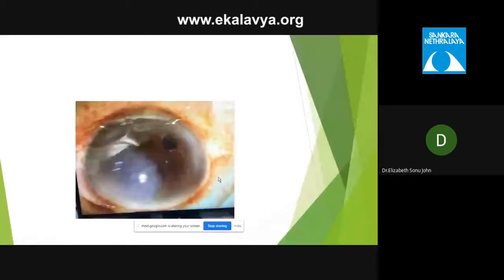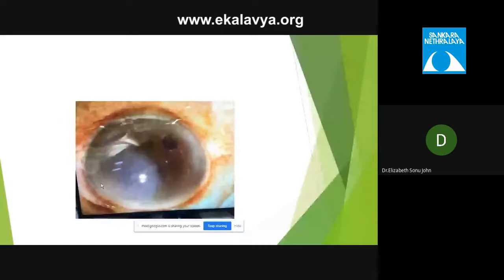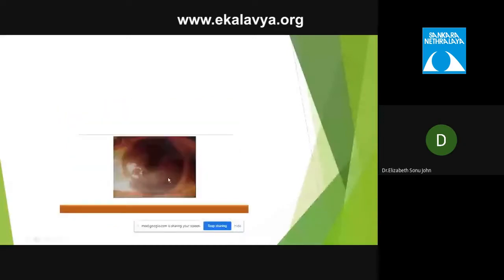So on the table, if you see a clouding or folds in the cornea, reassess whether there is a DM tear, whether there is a membrane fluttering. Sometimes you can mistake it for an anterior capsule. So before you try to remove it, put saline, remove the visco and see if it is a DM. So in this case, you can see here the detached DM. Sorry about the pictures.